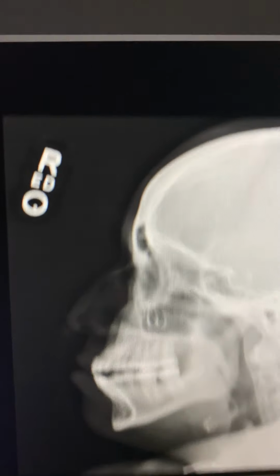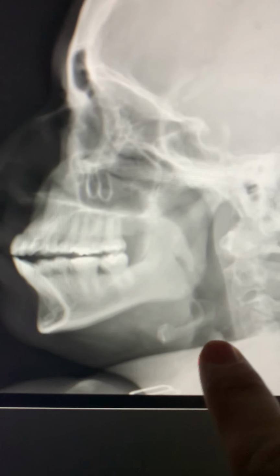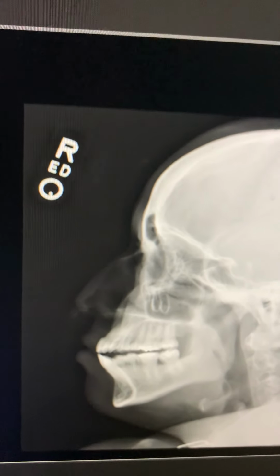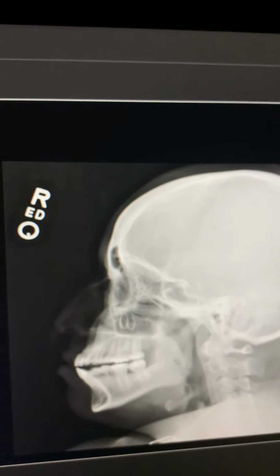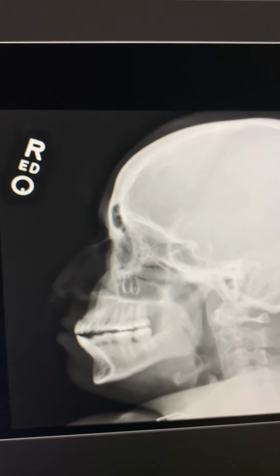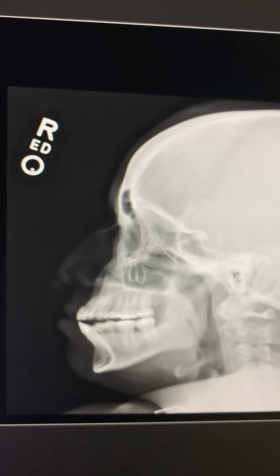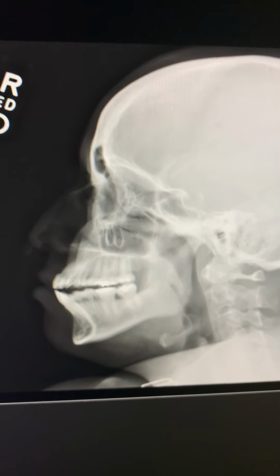The lateral was also, they told me to keep everything open because they want to see the airway and everything that is visual there. We marked it to the right side closest to the image receptor. The technologist on board asked the patient questions, and they didn't have a specific side that they were going to examine until I stepped in and asked the patient, and she said that she was having pain on the right side, more prominent, so I made sure to take a right lateral to demonstrate the side down.